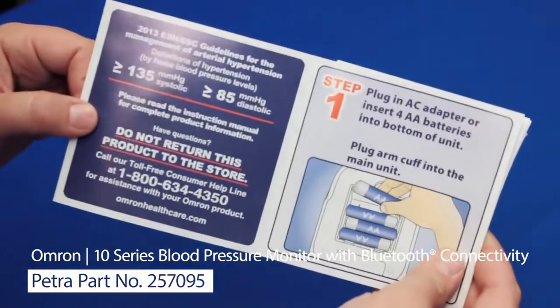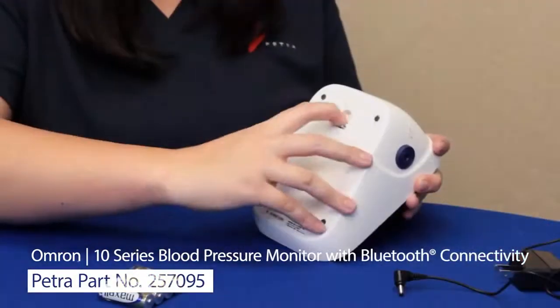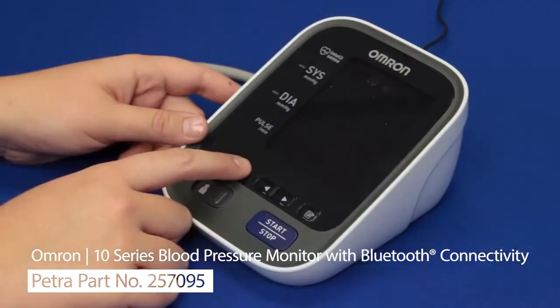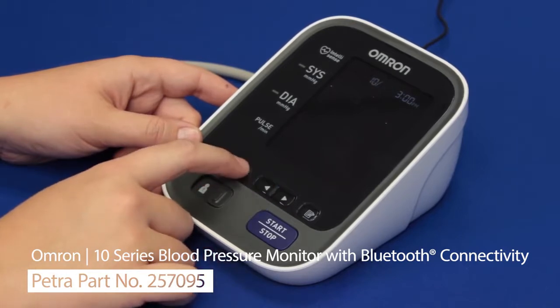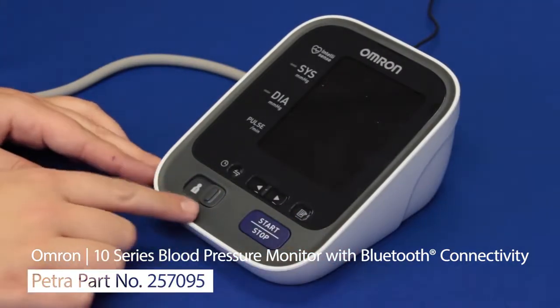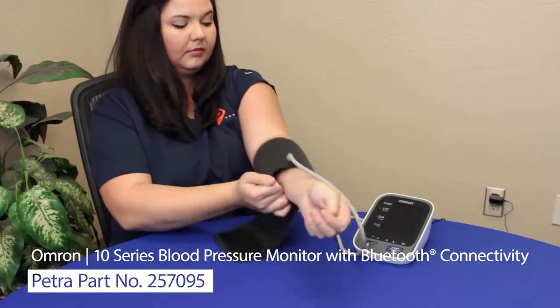Finally, there's the AC adapter and the full set of instructions. Both the quick start guide and the full manual have graphics and large type for easy reading. Next, insert the batteries or hook it up to a wall outlet, then set the date and time. Without setting the date and time it can't accurately track readings. This unit will save settings for two users, 100 readings each — simply slide the switch.